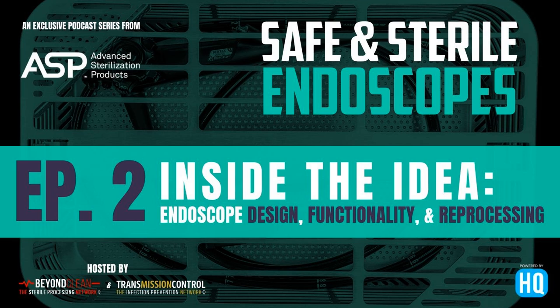But what are those extra steps, or what is it going to look like when we start talking about, hey, okay, we've made it through steps 1 through 10, and now we got to change because we got to shift to sterilization and what requirements need to be done for it to go into a STERRAD, low temperature sterilizer, versus high level disinfection, where we know it's a wet environment and that's okay. We know STERRAD and water aren't best friends. So we've got to make sure that everybody, especially if it's centralized in GI, understands what bone dry really does mean before something goes in the STERRAD.